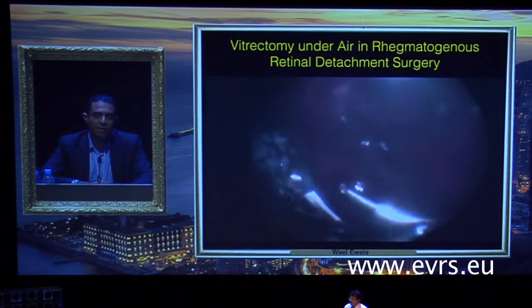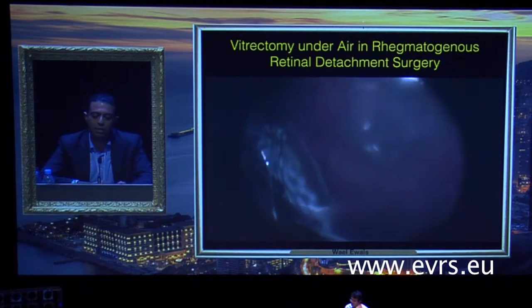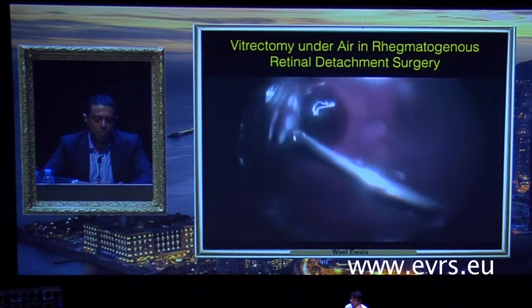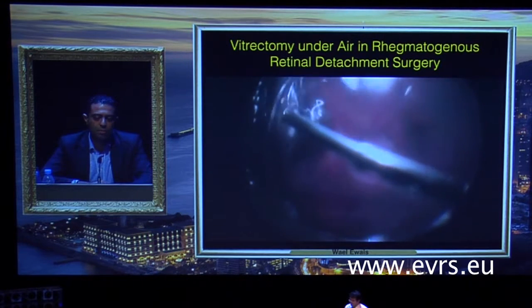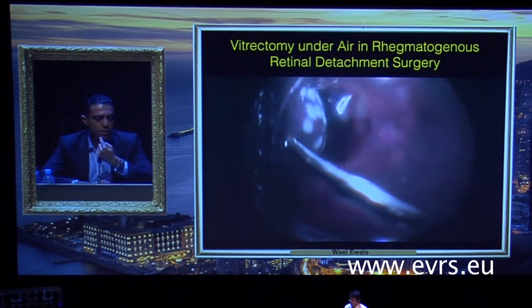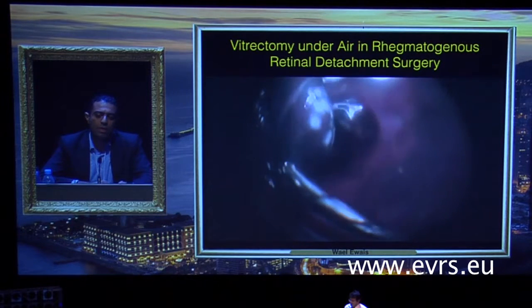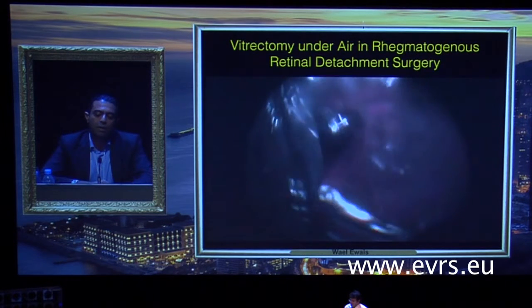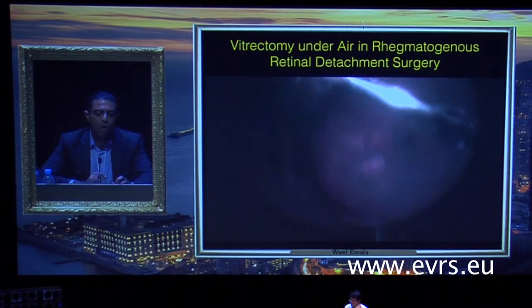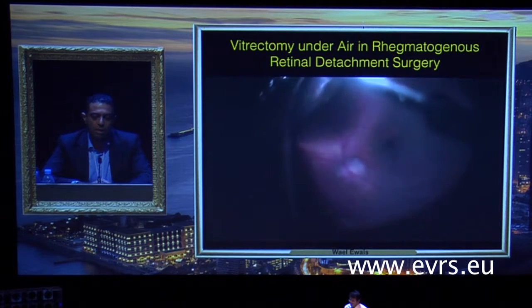to fill the upper 1/5 maybe of the globe. So I have two interfaces, and then I move with my probe at the periphery. The port is usually directed towards my side. I work zone by zone. In each and every zone, I don't make, of course, vigorous movement. I try to be almost stationary or with a little movement at a space.